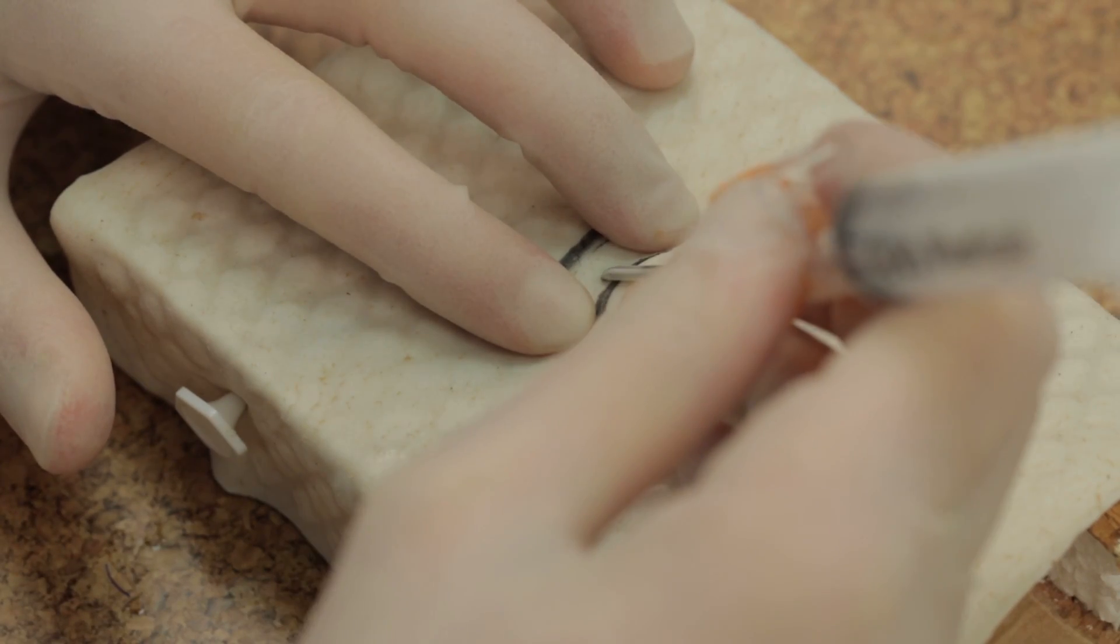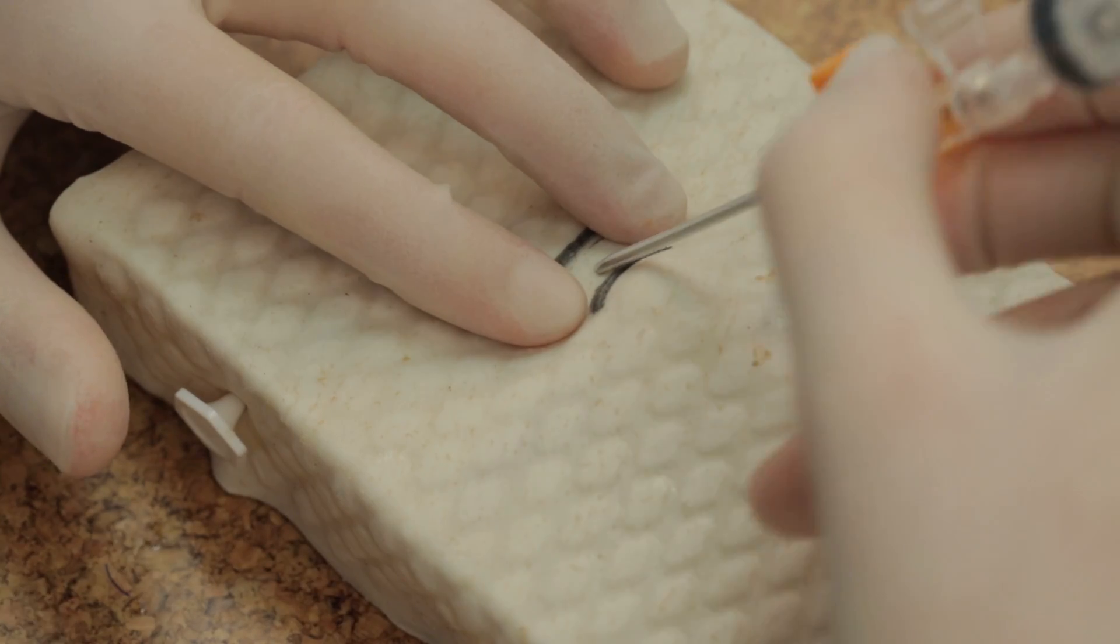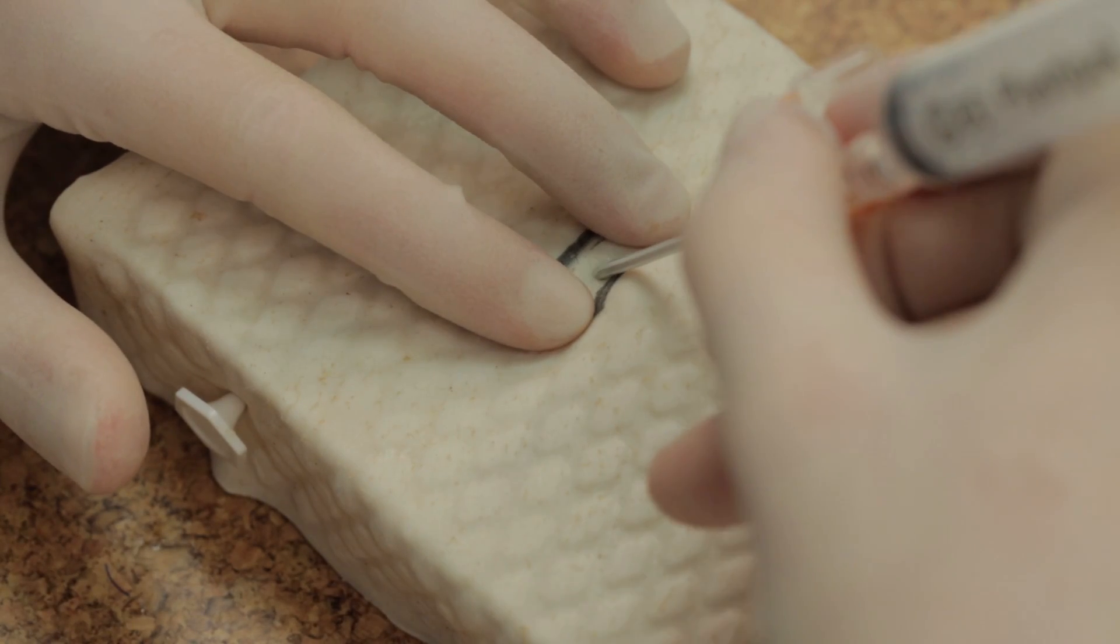Insert the cannula at roughly 45 degrees to the skin to pierce the cricothyroid membrane and enter the trachea.